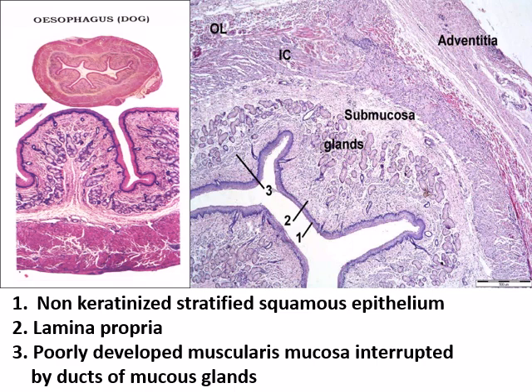This is esophagus. Is this esophagus for human or esophagus dog? From where I know, I'm going to tell you. As I told you, you're going to have a rounded structure or oval structure with lumen. How am I going to differentiate?